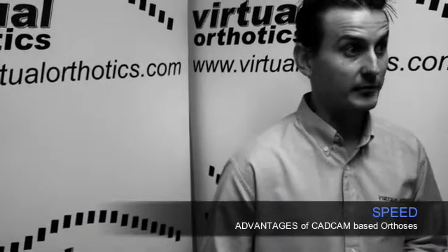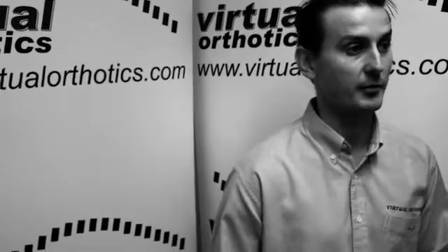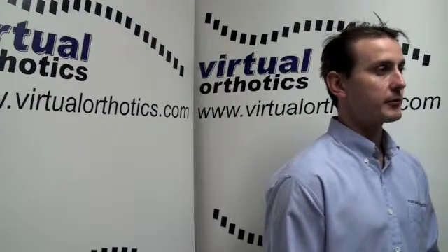The main advantage of CAD-CAM based manufacture is accuracy and speed. Accuracy is very important obviously to your patient because you get back exactly what you prescribe. It allows the patient to have a better fitting device because it's more accurately constructed and more accurate based on the podiatrist's prescription.